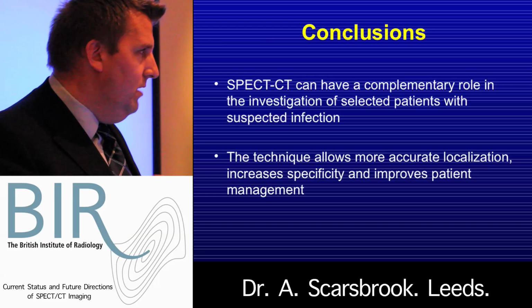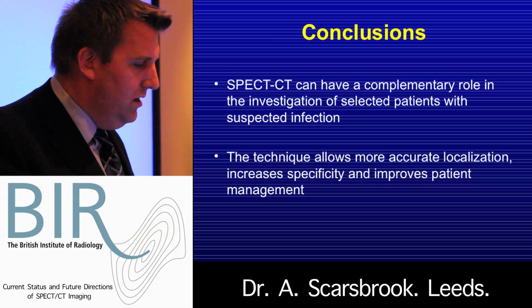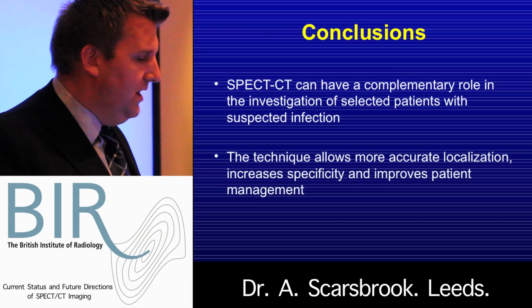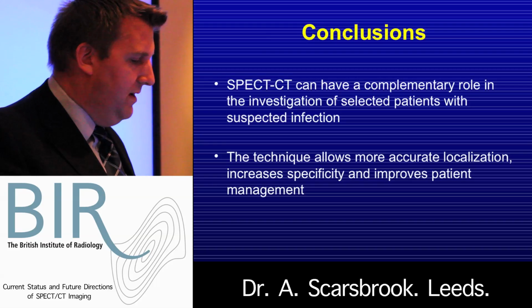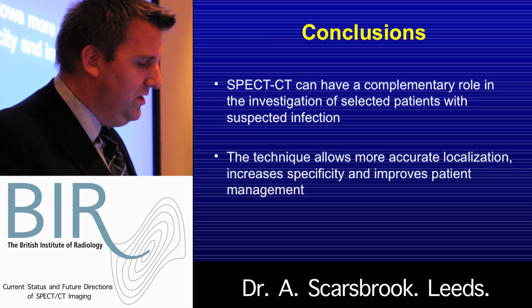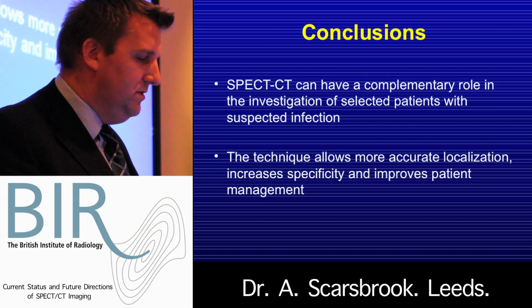So hopefully I've speeded through things, but not lost things in translation. I think I've shown that SPECT-CT can have a complementary role in the investigation of selected patients with suspected infection because of its ability to allow more accurate localization and increasing the specificity, which in itself helps with patient management.